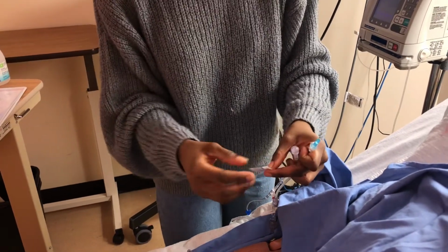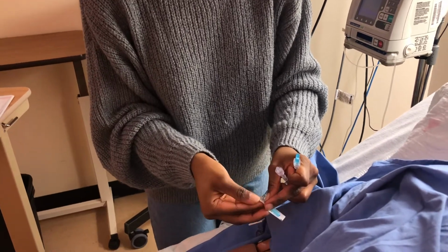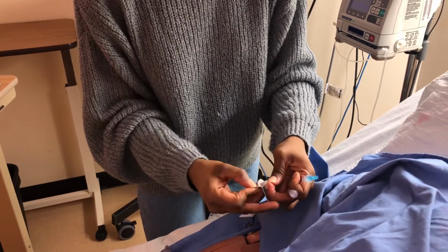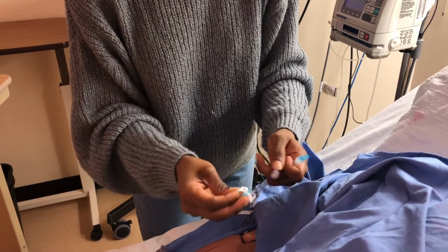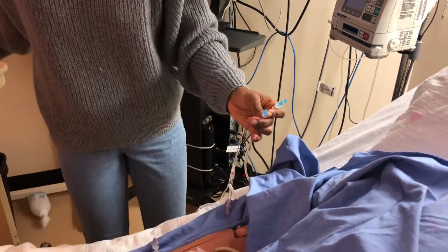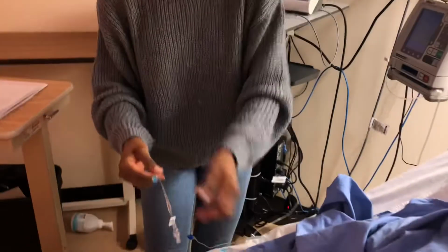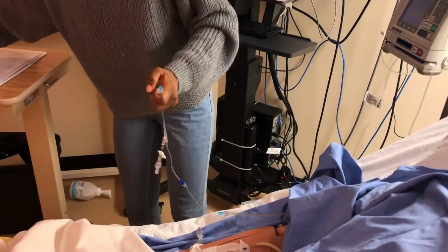So there's two boards there, and then it should have been. So I'm gonna cover this, okay? Oops. And I'll leave this here. So now I would attach this. I will clean that first.